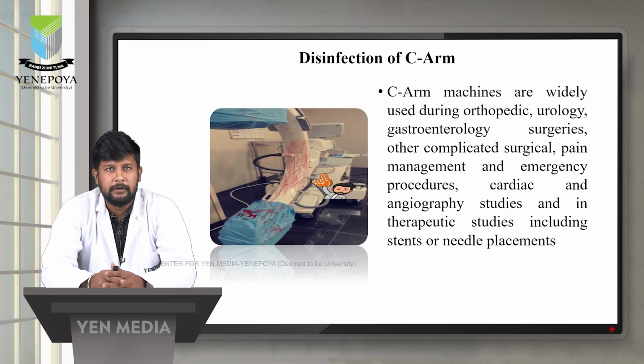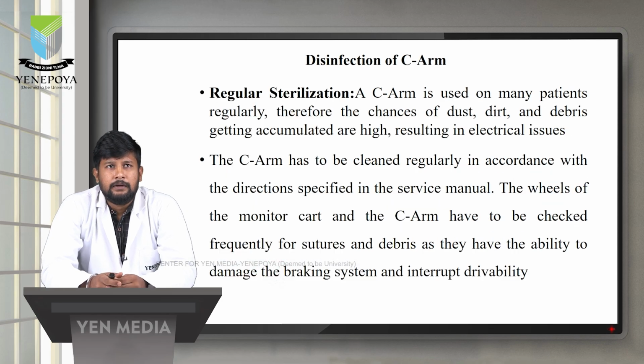Next, coming to the disinfection of the C-arm. C-arm machines are widely used during orthopedic, urology, gastroenterology, and other complicated surgeries, pain management and emergency procedures, cardiac and angiography studies, and in therapeutic procedures including stents or needle placement. Regular sterilization of the C-arm is necessary.